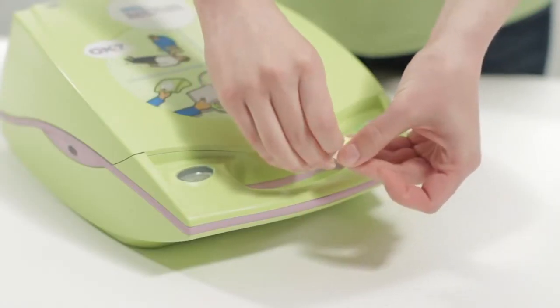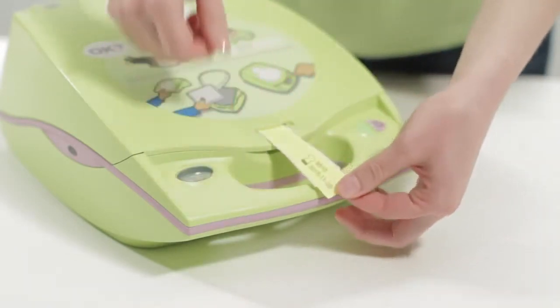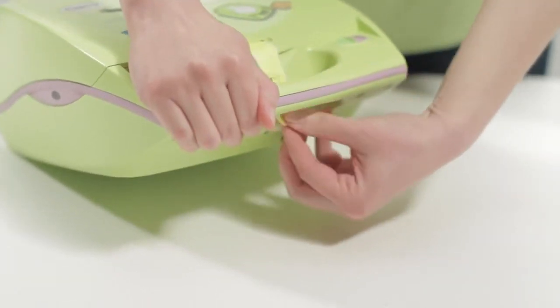Finally, tape down the expiration date tab. Separate and tear off the plastic backing on the tab. Then secure the tab like a piece of tape.